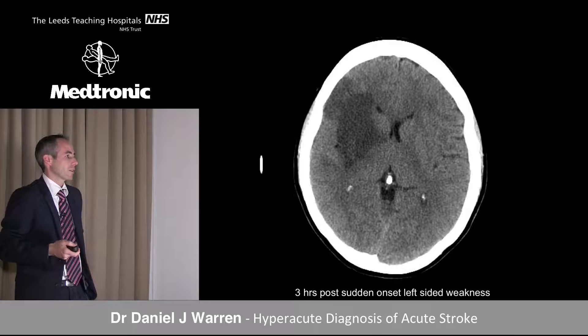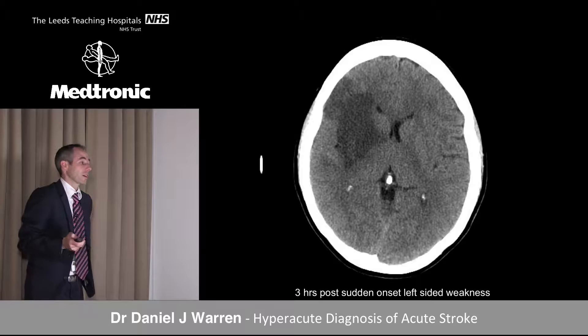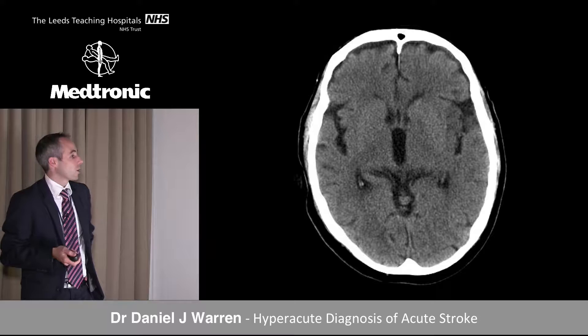That's the delayed imaging showing the actual infarct area. The caudate was actually preserved, although on the initial imaging it looked like it was slightly reduced.